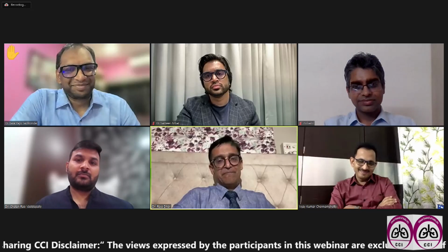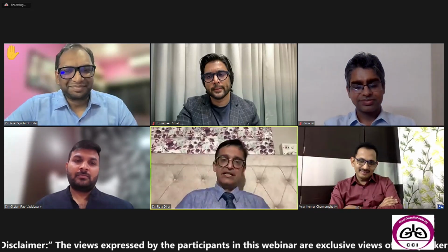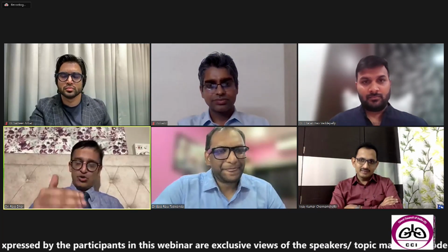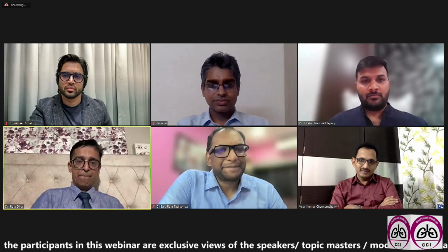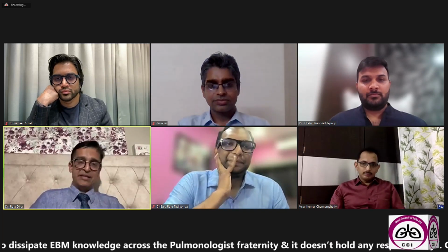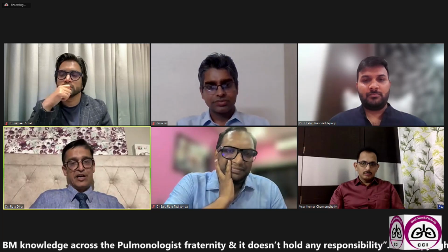However, what Vijay is talking about, for the audience, is the concept of having crush artifacts when you use a traditional biopsy. I was going to come to this question, but we'll talk about this now. When you start off doing cryobiopsies, and I don't know what the experience is for the rest of the panelists, the pathologists also have a learning curve. Because you have an ice ball within, the tissue looks frozen. The pathologists need to learn how to look at this tissue, and there's a learning curve even for them when they start reporting tissue taken by cryo, be that an endobronchial biopsy or a transbronchial cryobiopsy.